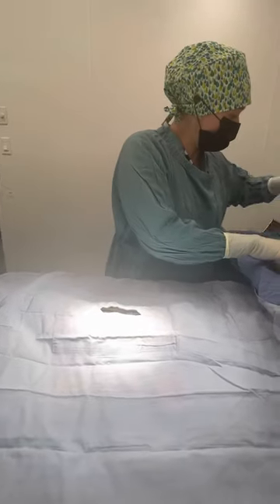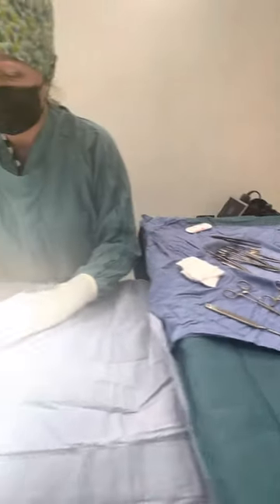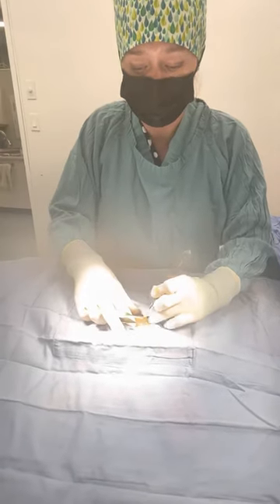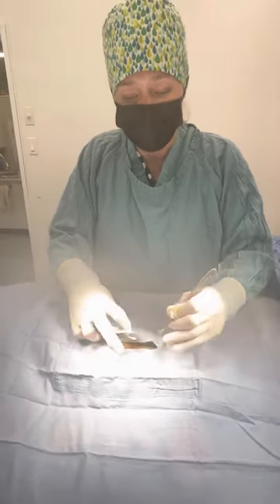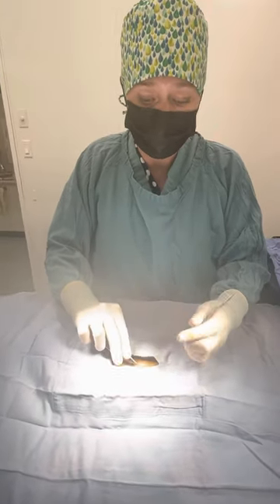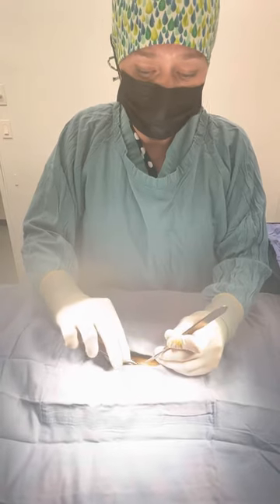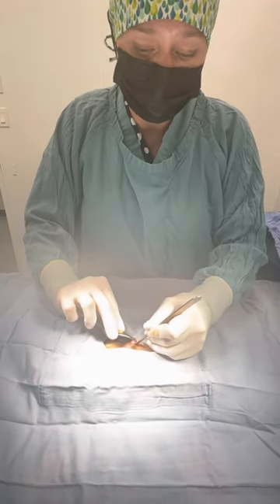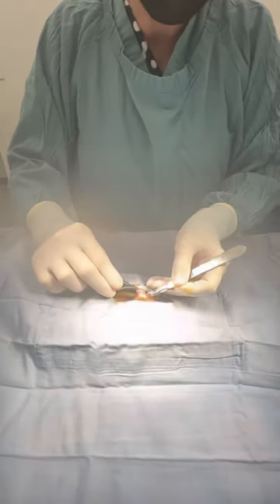There are many instruments that we use as part of the spay surgery procedure, but of course we gain access into the abdomen using a scalpel blade. This cat is only six months old but already has a fairly thick fat layer, so we'll just remove a little bit of that fat in order to have good access to the abdominal wall.